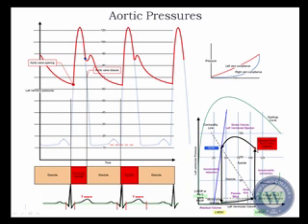Once you reach this point, this is the aortic valve opening point. The aortic valve opening point is consistent with here on this pressure volume curve, and how that generates the actual stroke volume, which is what this is generating. So your arterial line is really telling you how effective the stroke volume is on that patient. Eventually you reach the dicrotic notch, which is an indicator of the end of systole, which is also consistent with the aortic valve closure point.